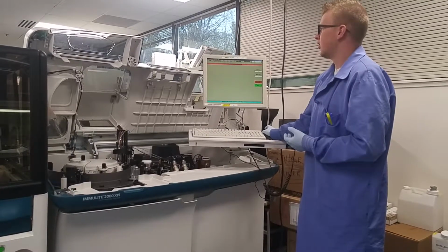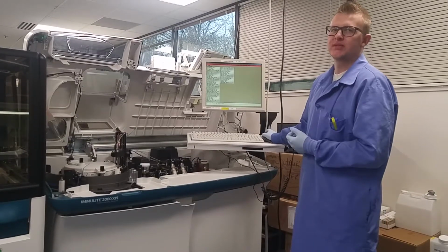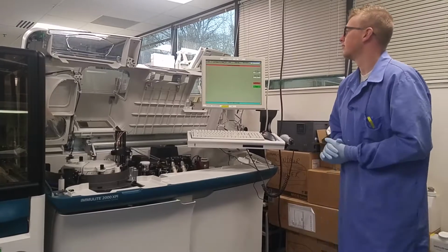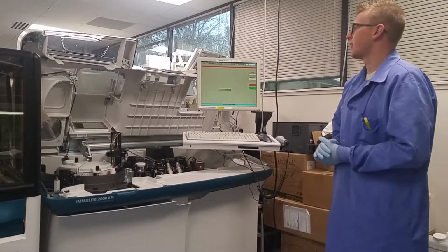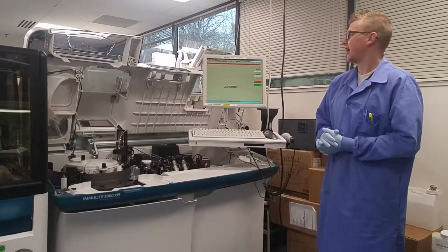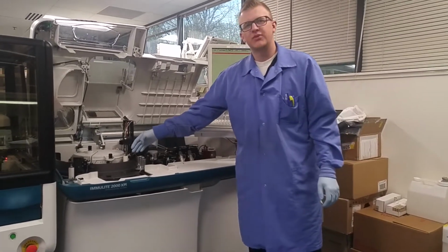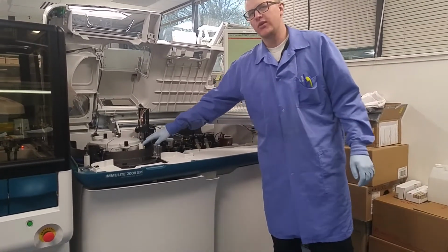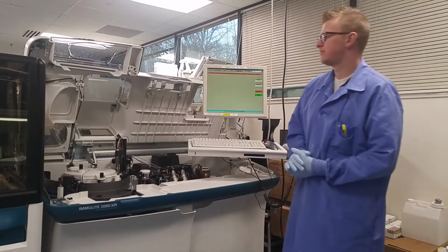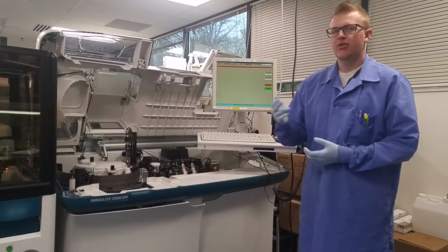So you go to load program, and then we're going to click on sample probe dispense angle, run. The message reads, before starting, make sure the sample probe is centered in the blind hole. Reconfigure if needed. So this sample probe needs to be aligned with the PVC tube that is inside of this bigger one. So we're going to press continue. The probe will raise. It's going to go through its calibration and align.